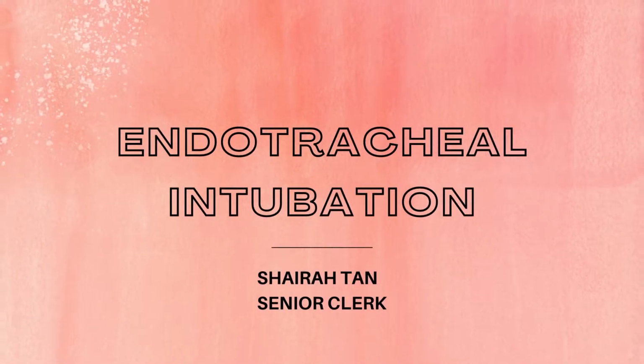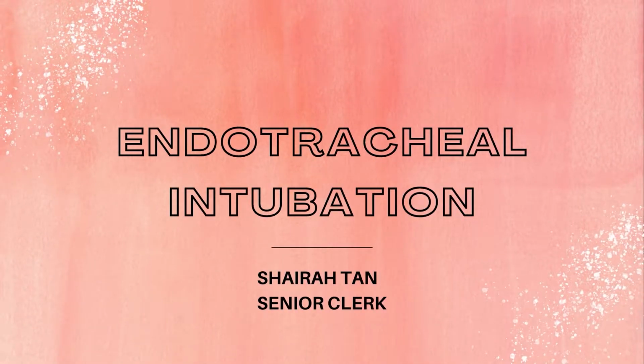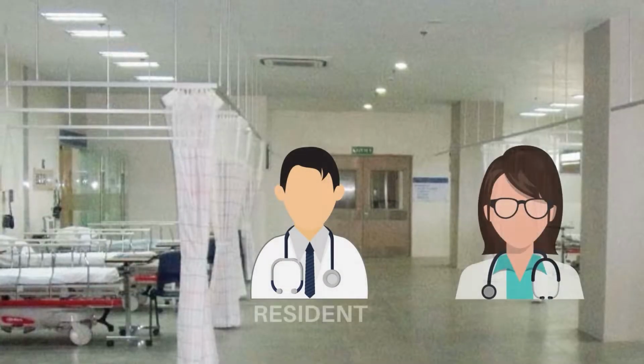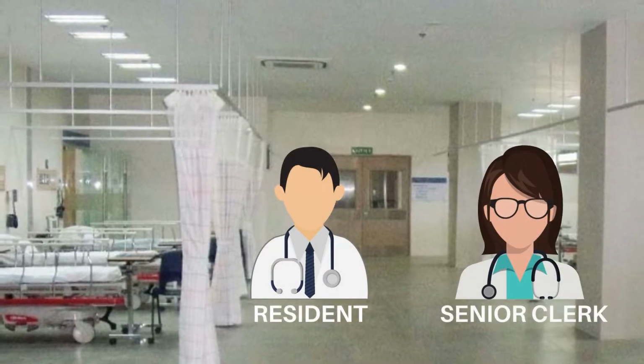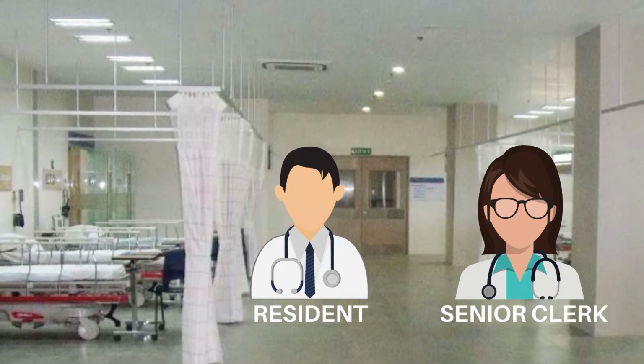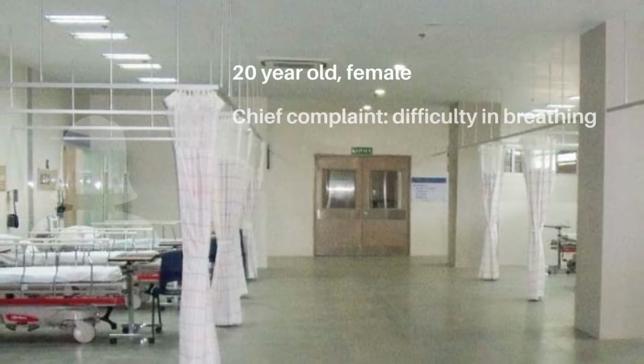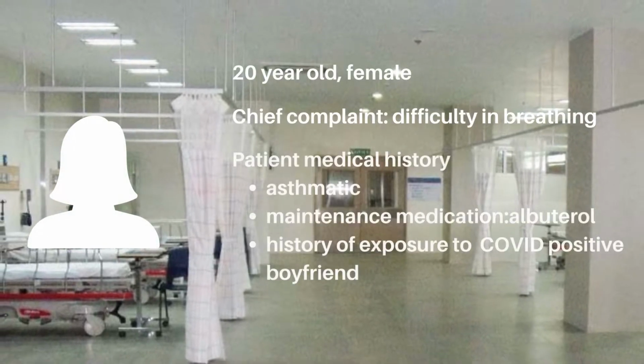We are going to talk about endotracheal intubation. For today's case, a senior clerk on duty at the emergency room was tasked by the resident on duty to perform the endotracheal intubation with his guidance. She was given a 20-year-old female patient who came in due to difficulty in breathing.